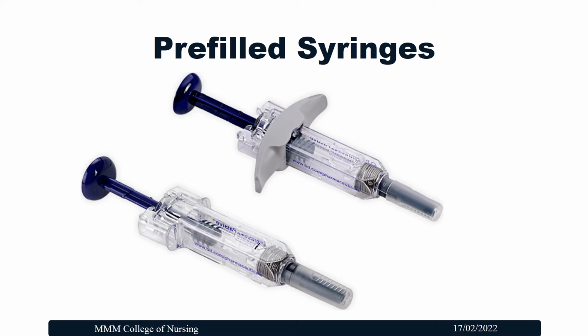Here we can see the pre-filled syringes which are readily available for administration, and the needles are also permanently fixed with the syringes. So after single usage this has to be disposed.